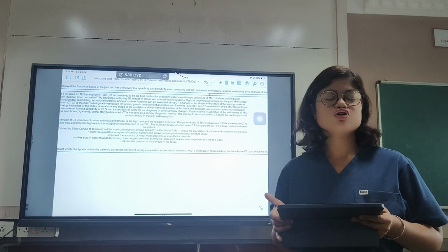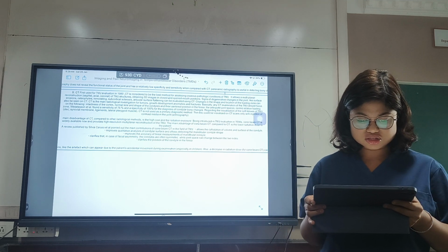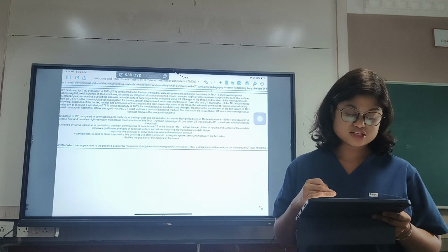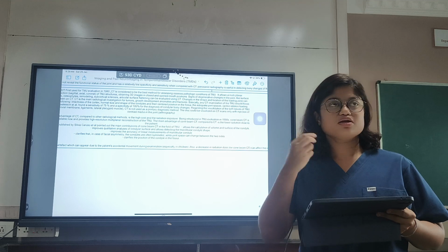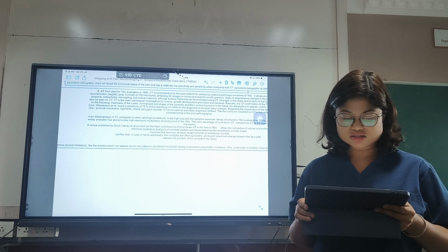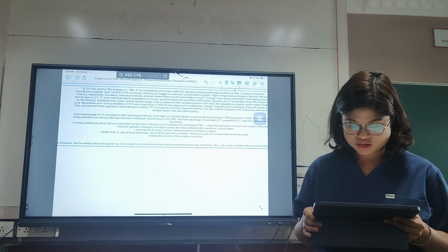Regarding the visualization of the soft tissues in the TMJ, that is the disc, synovial membrane, ligaments and the muscles, CT is not used as a primary diagnostic tool. The disc could be visualized on CT scans only with injection of contrast media into the joint, that is known as arthrography. Coming to the main advantage of CT, it is highly accurate for bony changes. The main disadvantage of CT is its high cost and high radiation exposure.